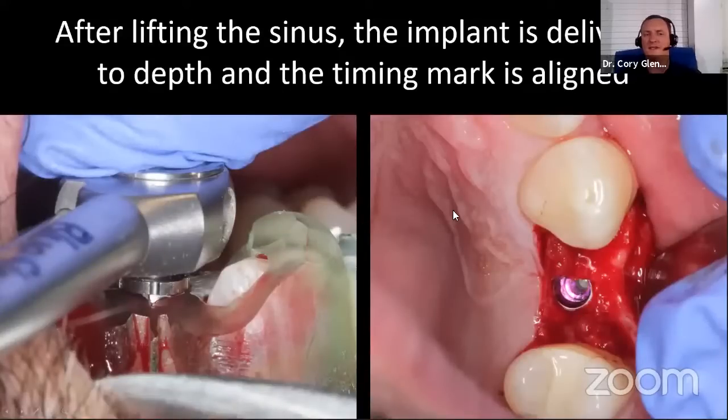And then once he placed a little bit of bone graft in there and lifted the sinus, now he places the implant. And you can see the picture on the left has the mark on the driver. There's six of these. They all correspond to the flats of the implants. So here's my timing mark, and I've got to make sure that the driver mark lines up exactly to the timing mark. So we did that. Our stopper is bottomed out, so we know it's at the right depth. And when we remove the guide, this is our implant.